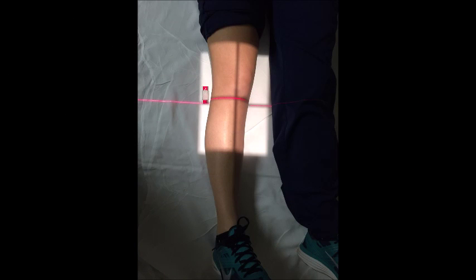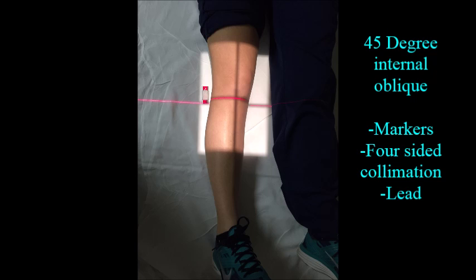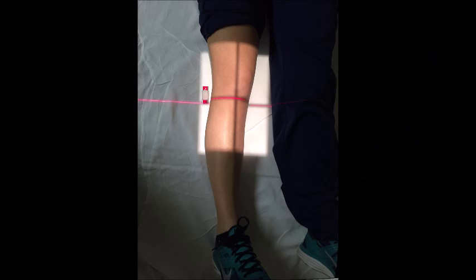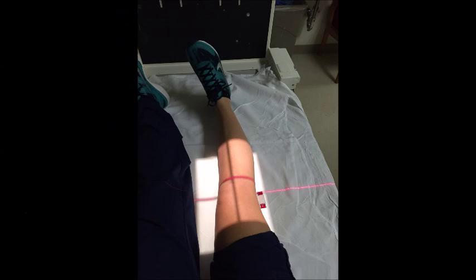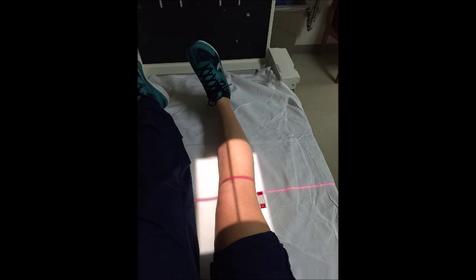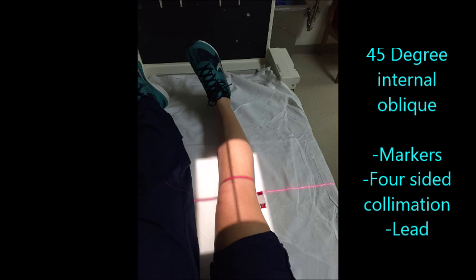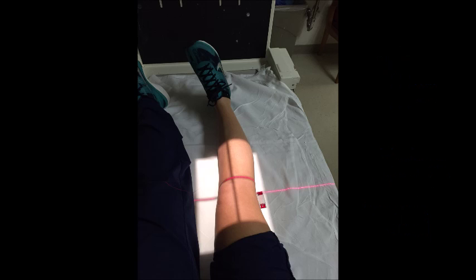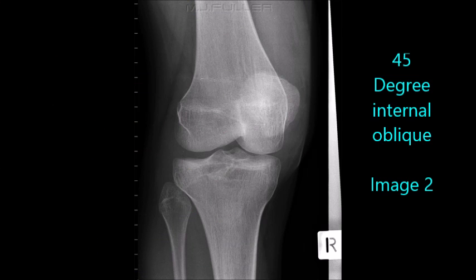For the internal oblique, rotate the entire leg internally 45 degrees. Be sure to take the angle off of your tube. Direct the central ray to the midpoint of the knee at a level half an inch distal to the apex of the patella. With collimation, be sure to include part of the femur and tib-fib.